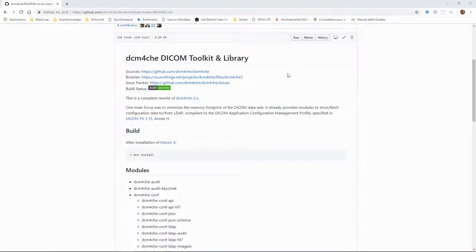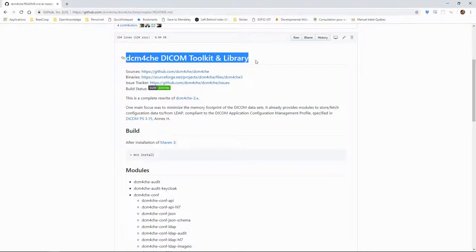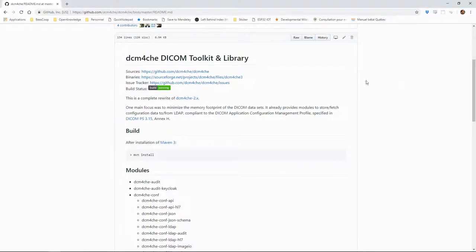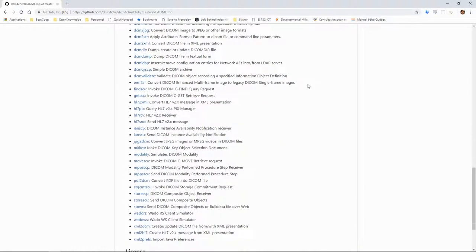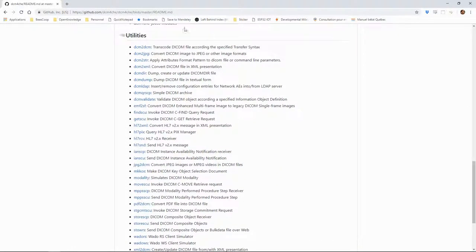We could read an entire DICOM file this way, but it would be impractical. It's better to use tools such as this one, the DCM4CHE toolkit. DCM4CHE contains a lot of tools and programs which can help us deal with DICOM files.